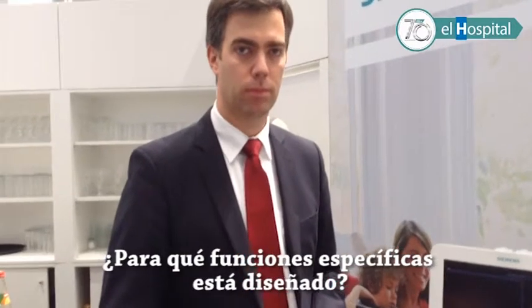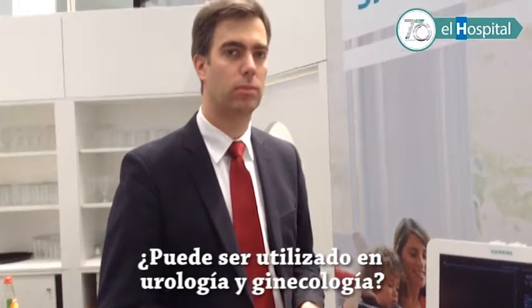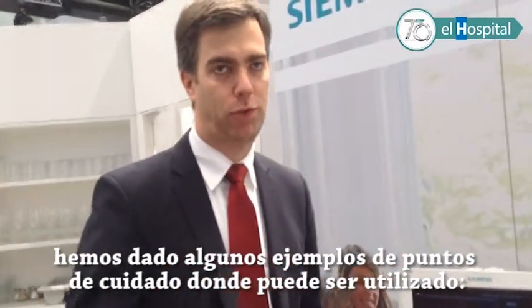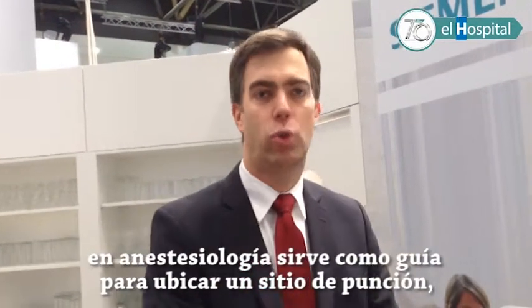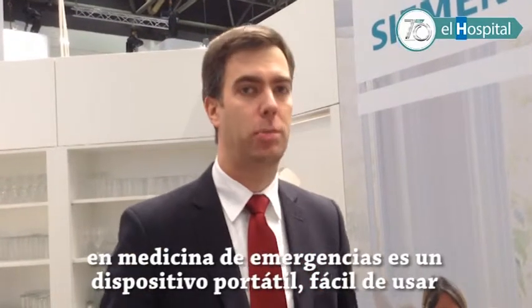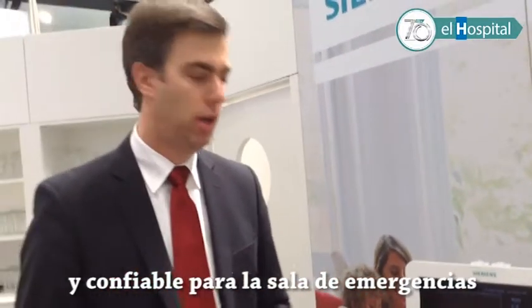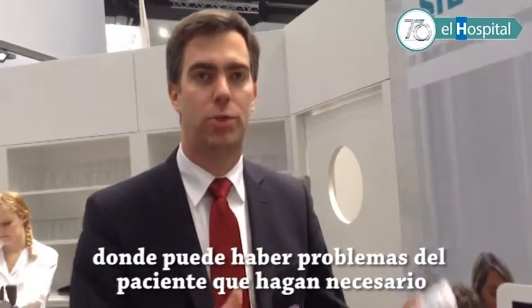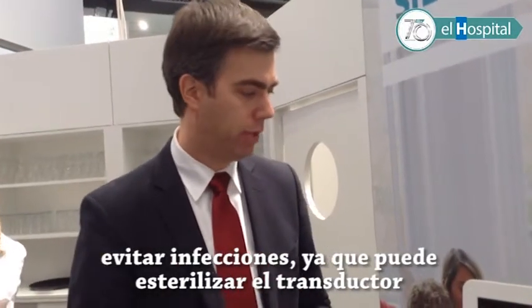In all countries in Latin America. What specialties is it designed for — can it be used in urology, gynecology? The point-of-care applications are really the focus. For example, in anesthesiology to do a nerve block and insert a needle. It can be used in emergency medicine, because it's very hectic in the emergency room and not having the cable improves workflow. It can also be used in intensive care units, where you may need to avoid any infections because you can't sterilize the patient's environment.